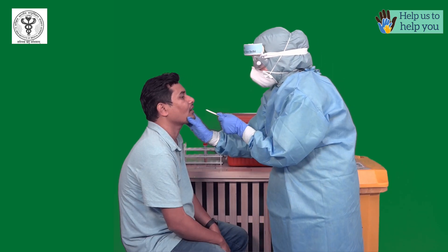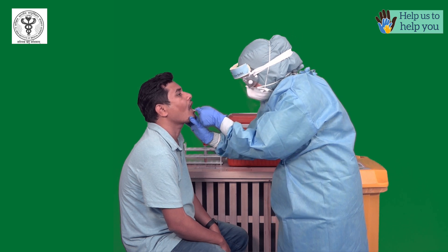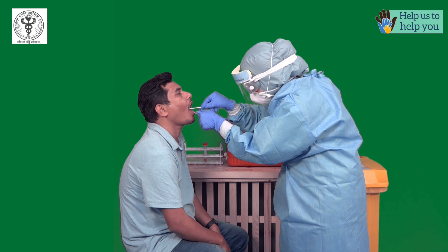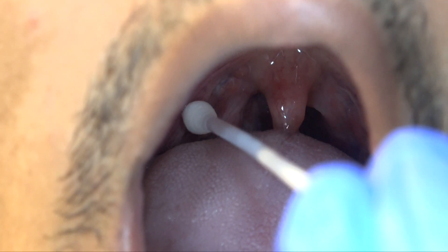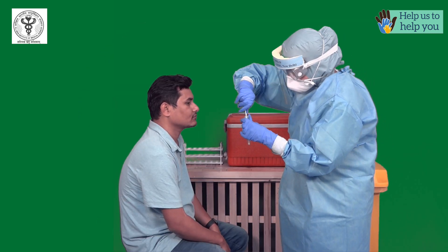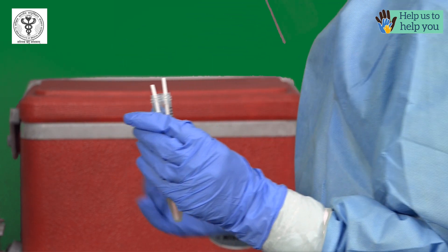For throat swab, press the tongue of the patient using a tongue depressor. Insert a new swab into the throat and take a sample from the throat wall. Remove the swab slowly and insert it into the viral transport medium and break the applicator stick.